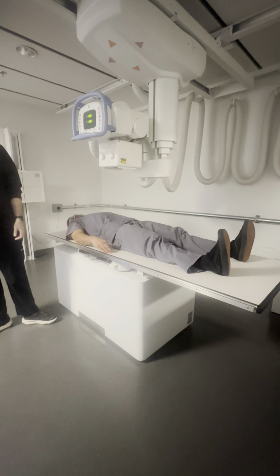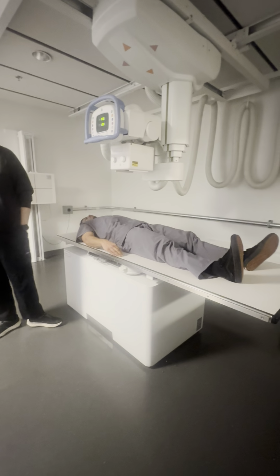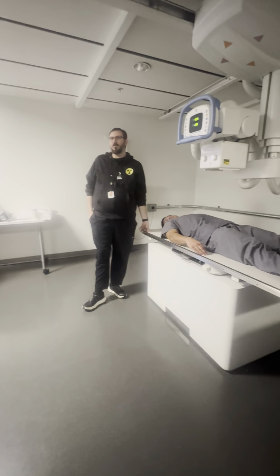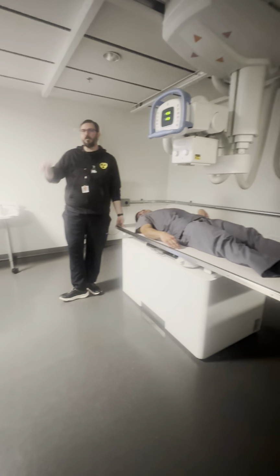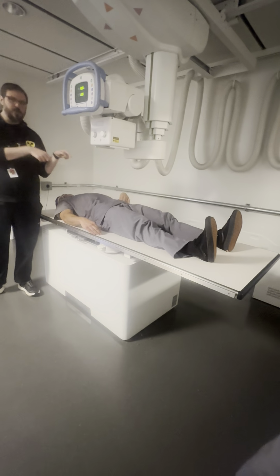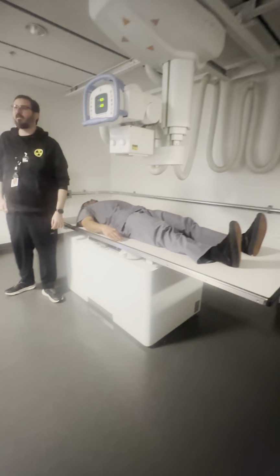Is it common in hospitals to do like 15-minute? You're supposed to do 15 minutes. Do they do it is another question. I think my site does like 0, 30, 60. No, we do like 1 hour. Yeah, same. Like 1, 2, 4, 8 hours? Oh, you're doing inpatients. That's different. We're talking like you bring your outpatient in, they're on your table. Even with inpatients, they should be on your table for the first hour, then you send them upstairs for the additional hours. I know, but I'm saying that's not good practice.